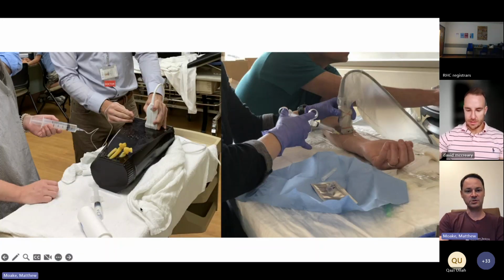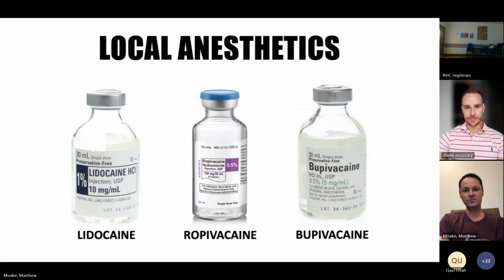Now, needle gripping and setup. If you're using a block needle, these are going to be connected to a tube, so you're typically going to need a second set of hands to do these well. I definitely have some EM colleagues who will manage to hold the syringe within the needle hand as well. It just makes for more dexterity to manage it: one hand on the probe, one hand on the needle. The benefit in the forearm blocks using the hypodermics connected directly to the syringe is that you can have control of the needle and the syringe all in one hand, so that you can do this as a single provider.